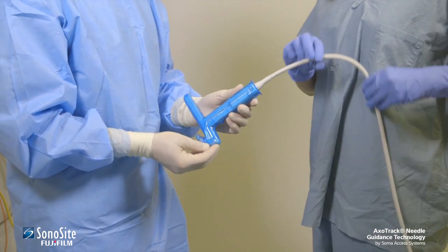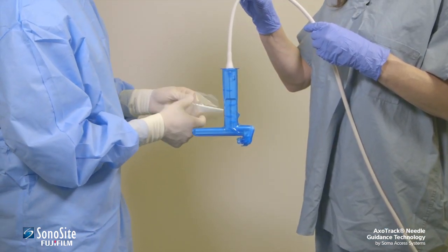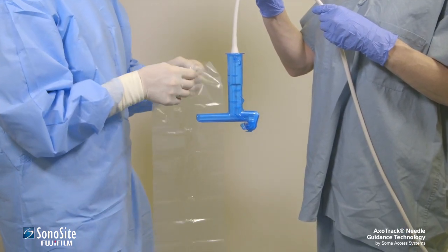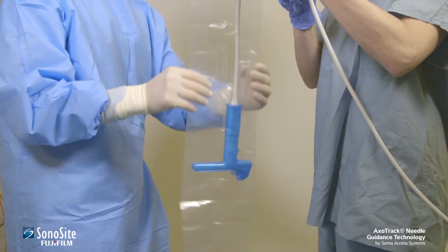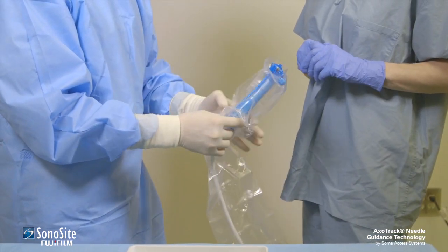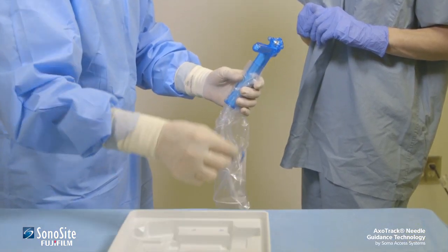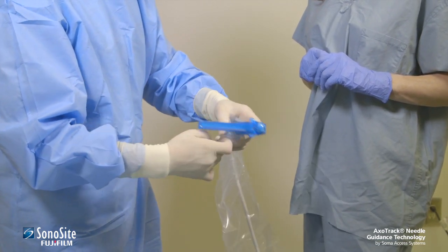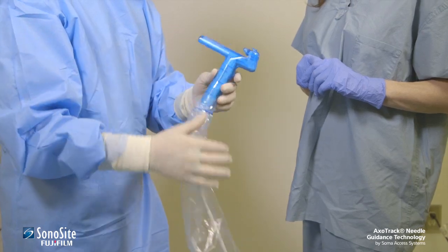To install the cable sleeve, the assistant holds the transducer by the cable and lures it into the cable sleeve being held by the practitioner until it reaches the distal end of the sleeve. At this point, the sterile practitioner grasps the transducer and secures the sterile sleeve to the shield with an elastic band.